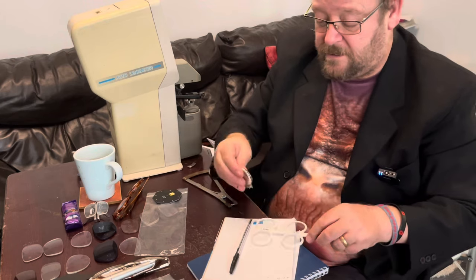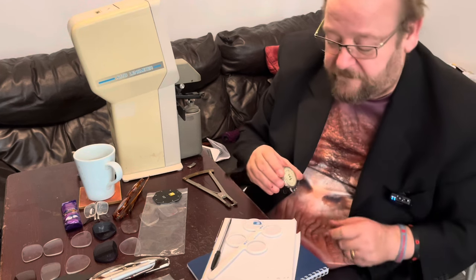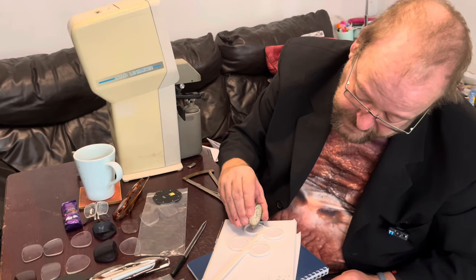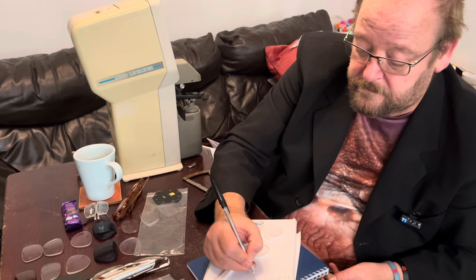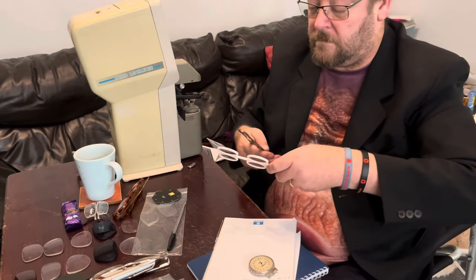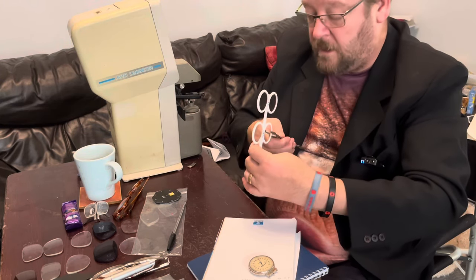Now for the front surface measurement. On the minus side the front surface is minus 0.50. The back surface is minus 0.25. And the thickness is 2.3 millimeters.